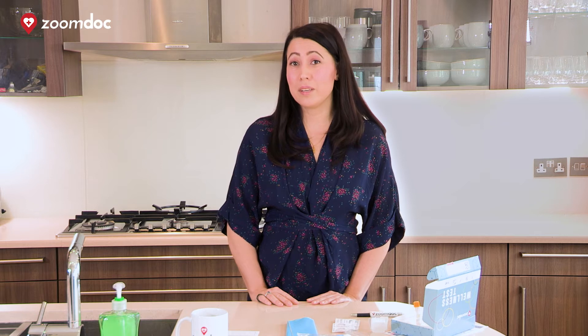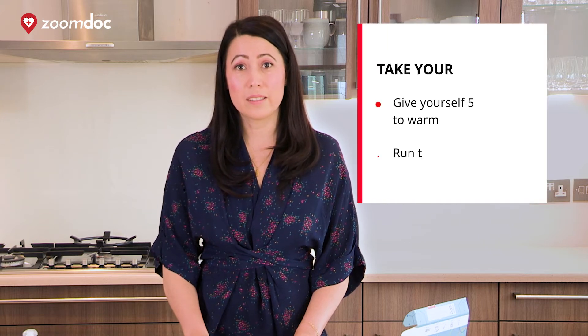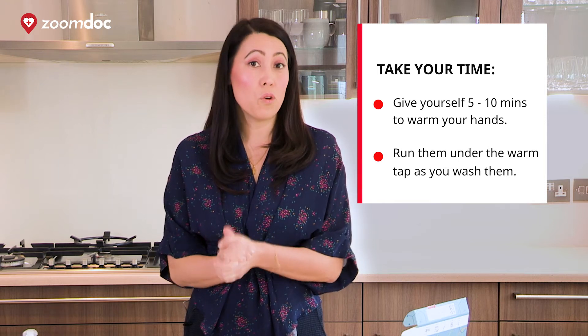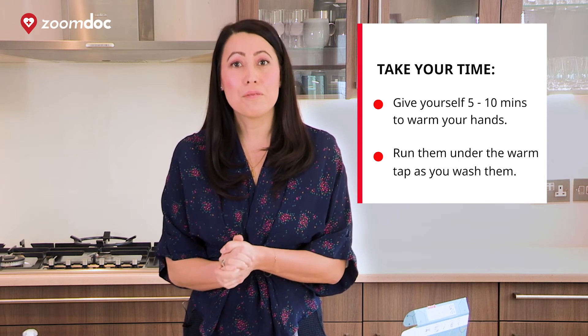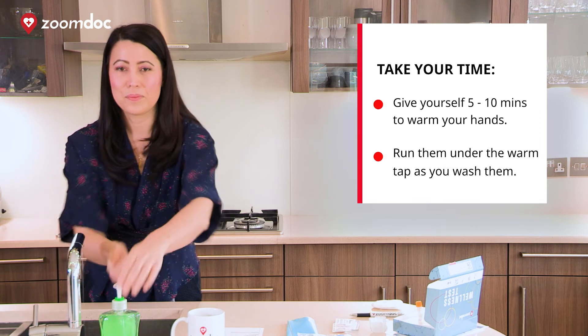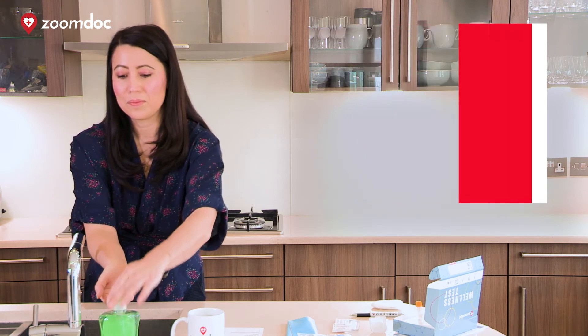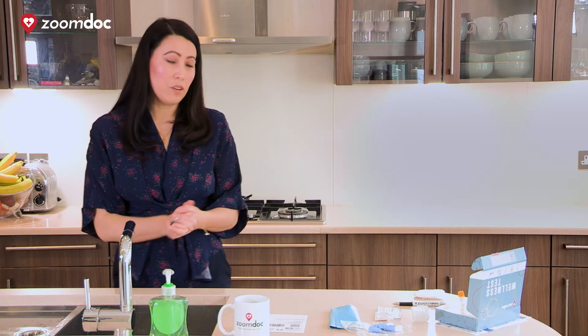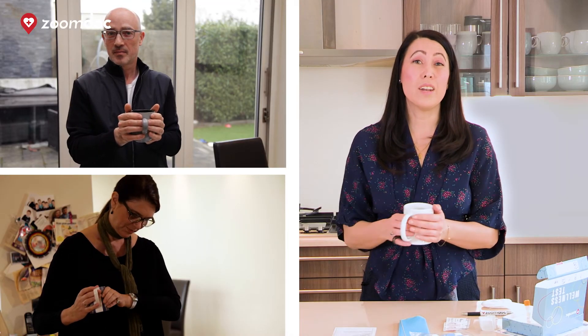You're going to need some kitchen towel and/or a cotton pad. Next, it's very important that you warm your hands. The best way to do this is running your hands under the warm water tap for about five minutes. If you're worried that your hands aren't warm enough, it might be worth holding a warm mug for 15 minutes before the test.